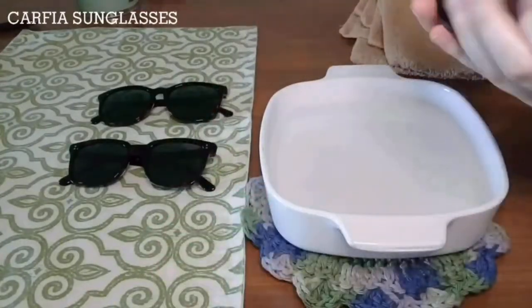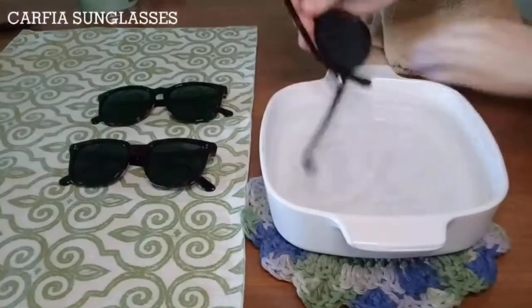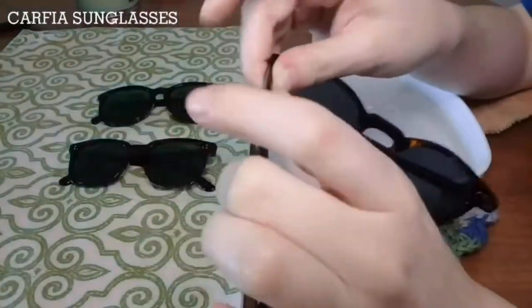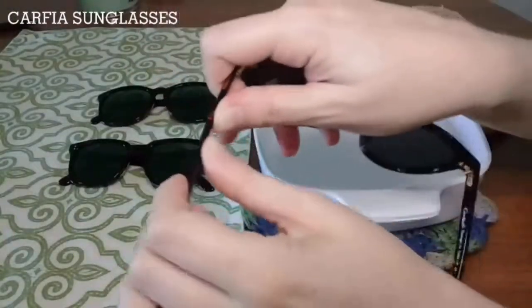So we're going to do the same thing with the other side. I'm going to fold in the side I just did and submerge the other side again. Okay. So now same thing for the other side. I'm going to use the index fingers to support everything again, and the thumbs open up the other side temple because it just helps.